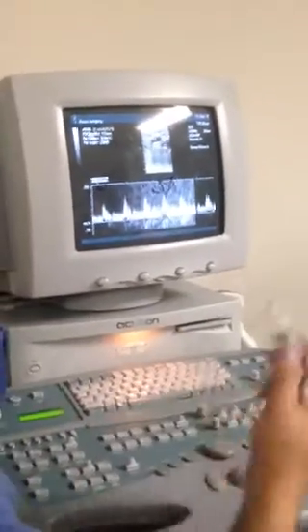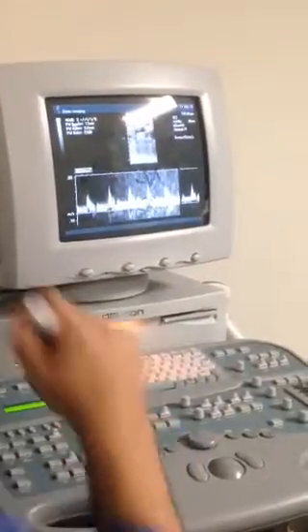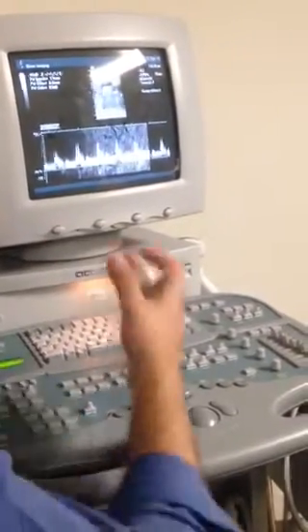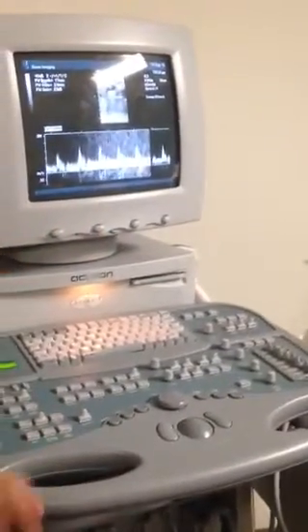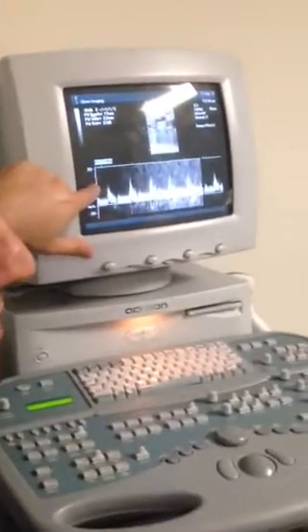And the problem is when you increase your gain, what happened here to the systolic window? It's gone. You're filling it in. When you're filling in the systolic window, it indicates there's a stenosis, but it's just a fake stenosis, right, Tori? Yeah, mistake. So keep an eye on this. You don't want the gain too high. What's the proper Doppler gain? The background of the waveform should be what? Black.